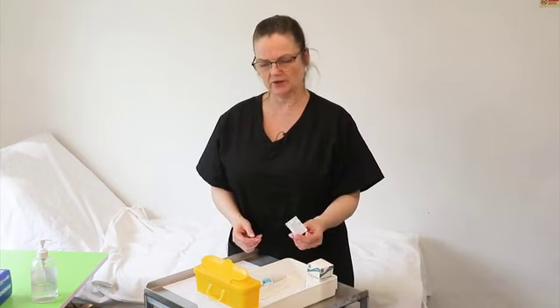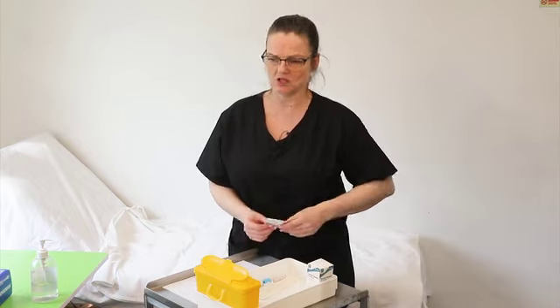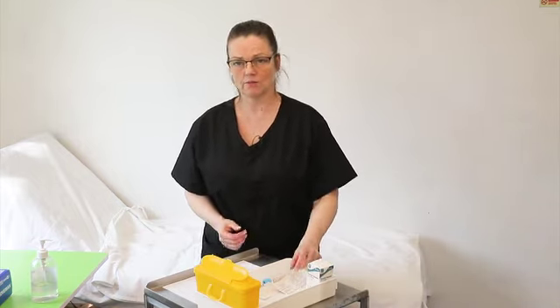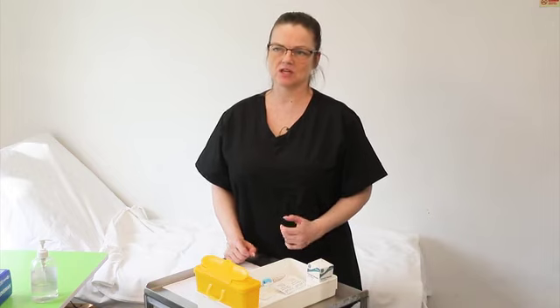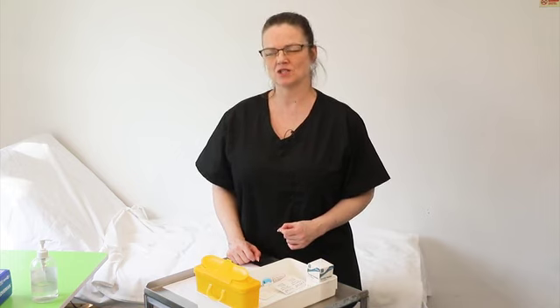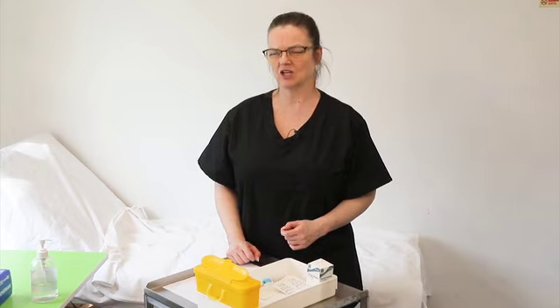Why are we using alcohol wipes in a subcut injection? You might be wondering, because maybe you're used to giving subcut injections and you don't clean the patient's area. So it's not actually completely necessary to clean the skin when you're giving an injection, so best practice tells us. But if a patient was dirty, if you felt that the skin was not clean, you would be expected to clean it.